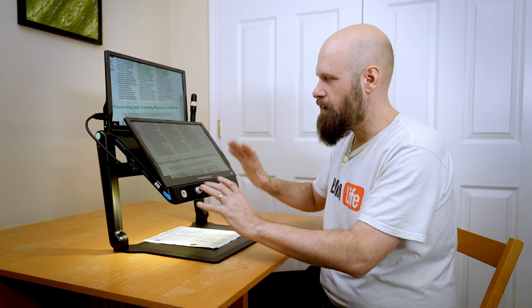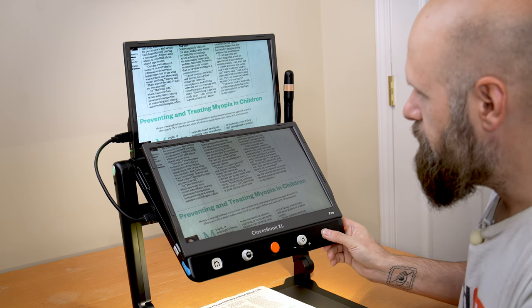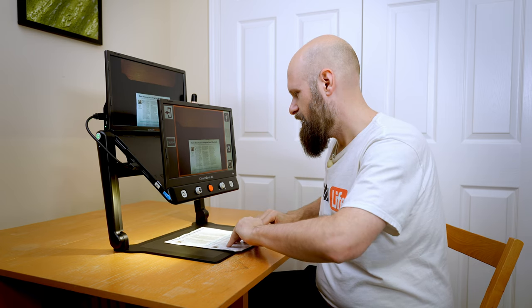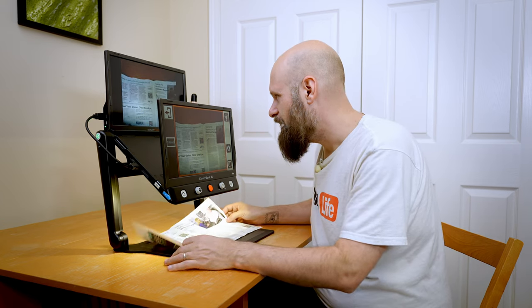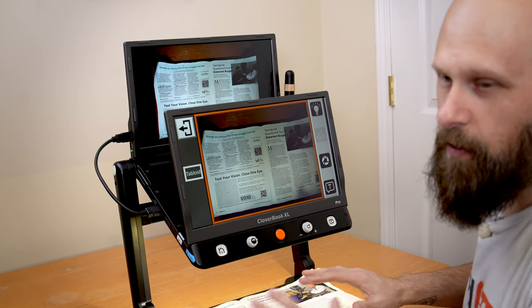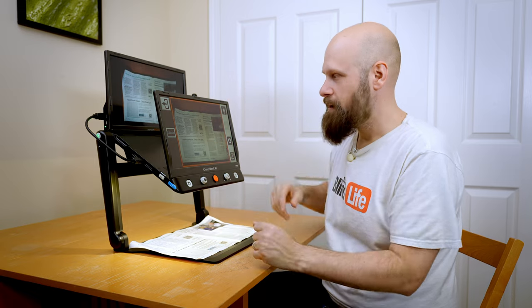Because we have a much larger device, we can scan a much larger surface. Press and hold the text-to-speech button to enter tabloid full page mode. From this view, I could open up an entire page and OCR it — even a two-page spread of a magazine or tabloid. This is the largest scanning area for an OCR device I have ever seen, at least for a device like this without a separate arm.